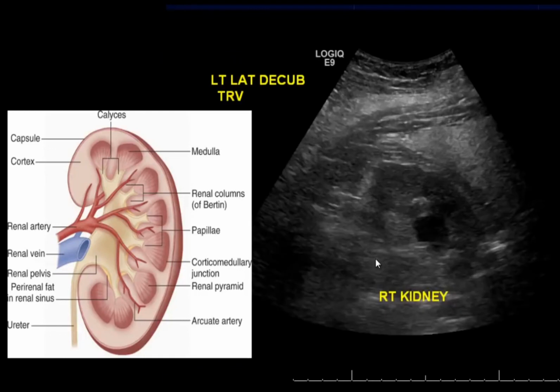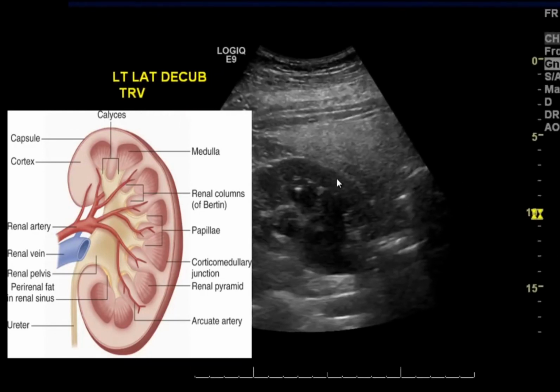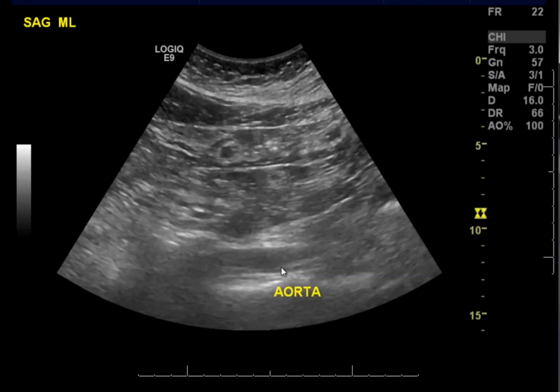This one still has a rim of renal parenchyma that is probably 15 millimeters. That's pretty good, so the kidney has not suffered atrophy yet. Here we see the abdominal aorta. And unfortunately, bowel gas and depth of the aorta sometimes precludes its display. But here we see the mid-aorta, and the walls of the aorta having muscular layers and sometimes atheromatous disease. You're going to see them very well compared to the cava that the walls are more delicate.